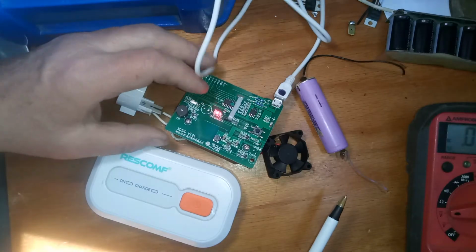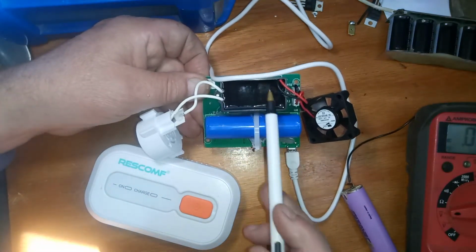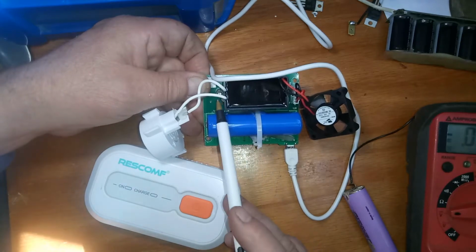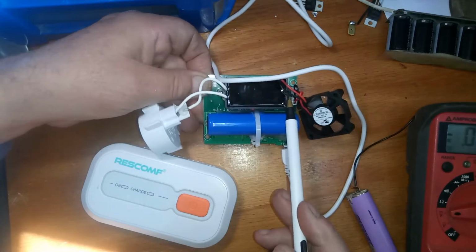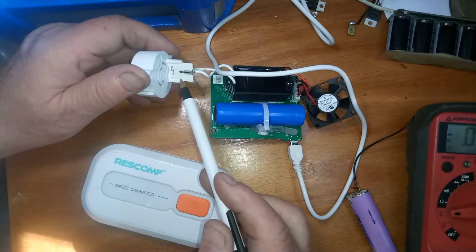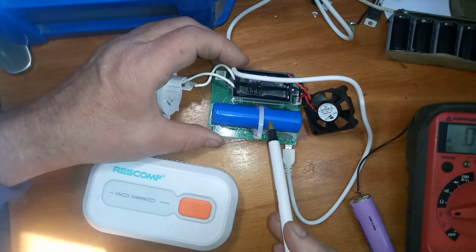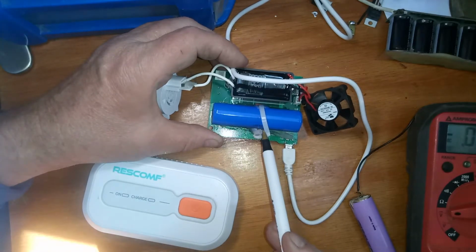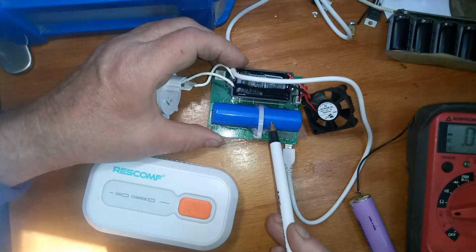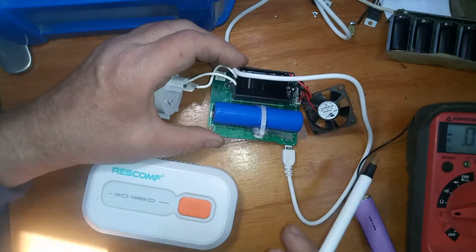So, this is the unit. And this is the high voltage unit. You can buy these on eBay as a separate module, and it goes into this ion generator. It's basically an arc pad. And this is the 2000 mAh lithium battery. This little fan pushes air through.